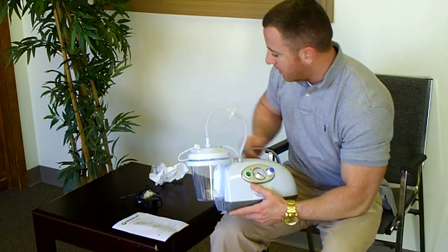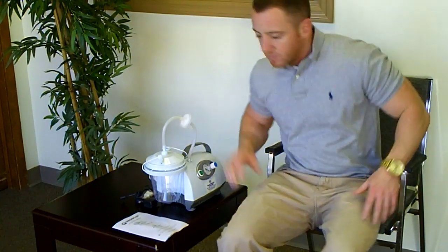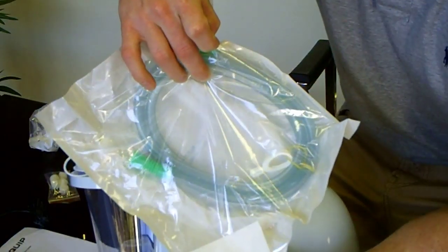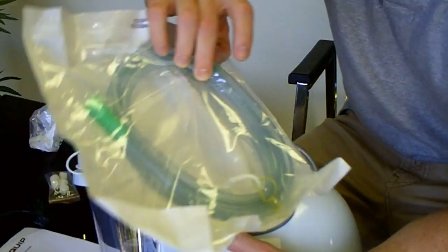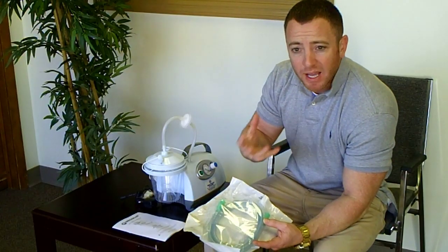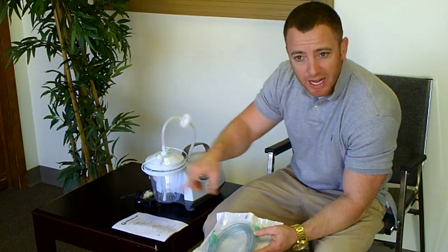The next thing that goes on is your tubing. Your tubing should look something like this. Now this is your regular suction tubing, and this is your filter tubing. There's a difference. If you're sucking an airway, you want to start at the machine and work your way back to the catheter.